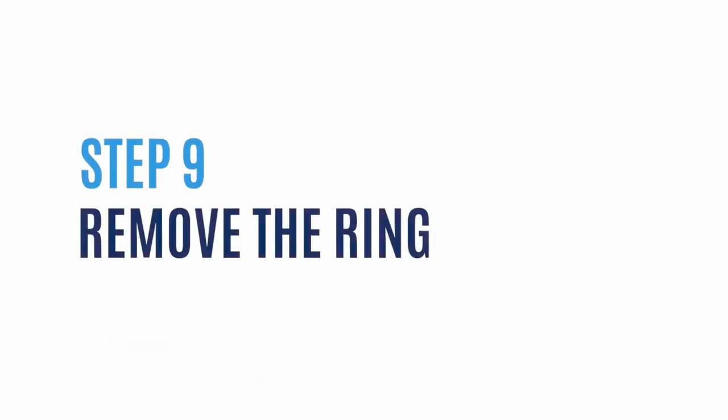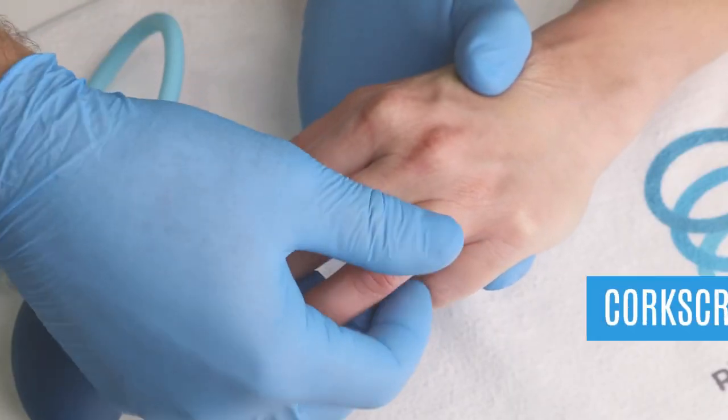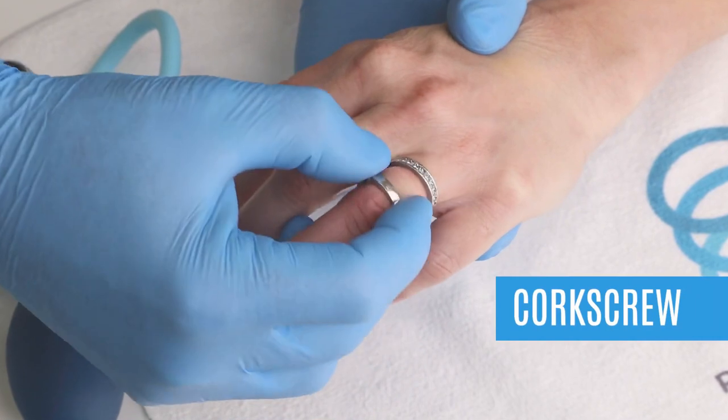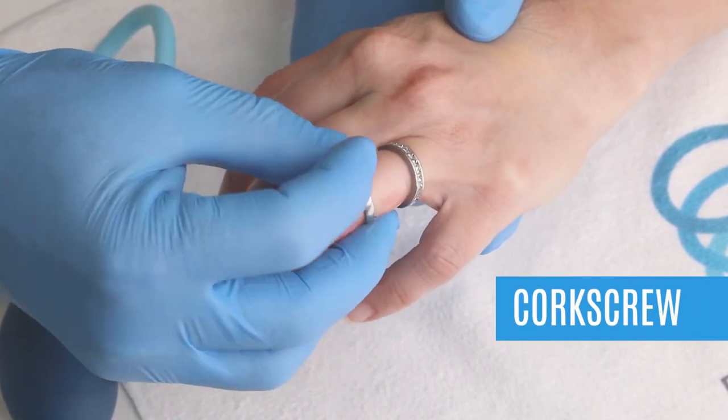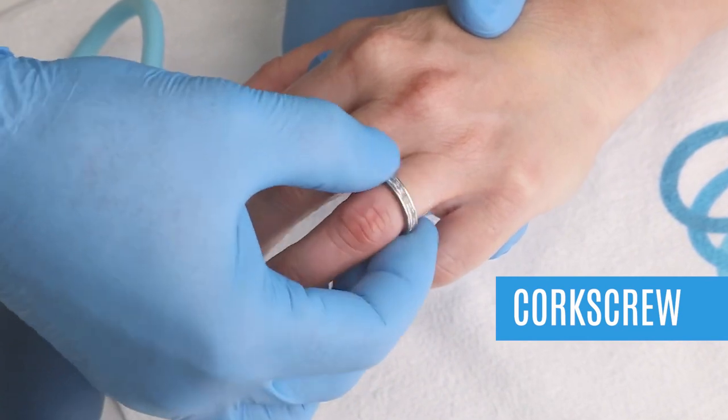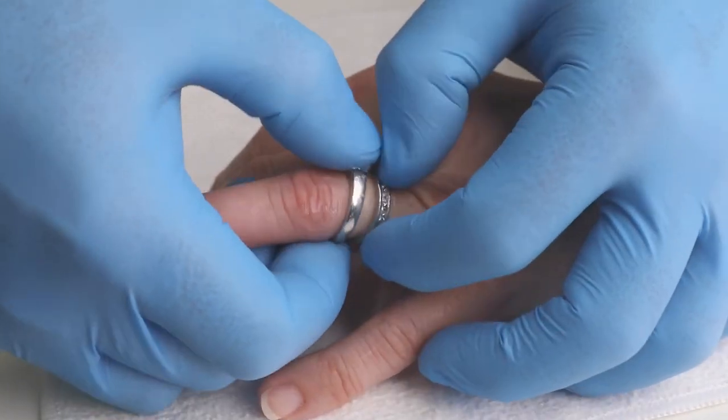Step 9: Now it's time to effectively remove the ring. One of our most successful techniques is the corkscrew motion. Now is the time for you to start that rotational motion in an attempt to rotate the ring off the finger. Do not rush. Don't worry. You have time. The finger will not immediately start to swell back up.